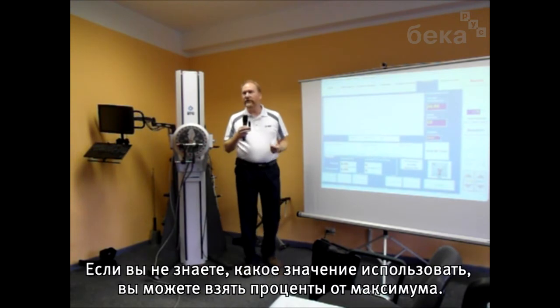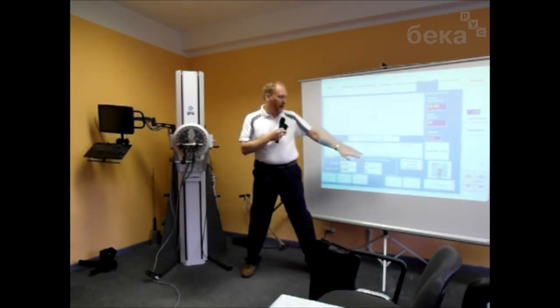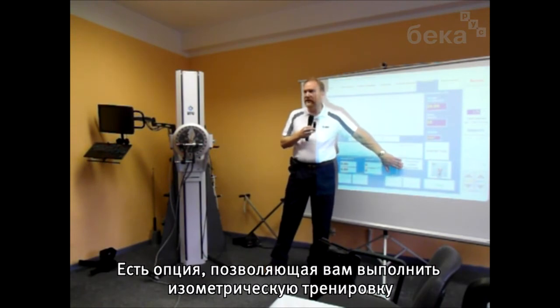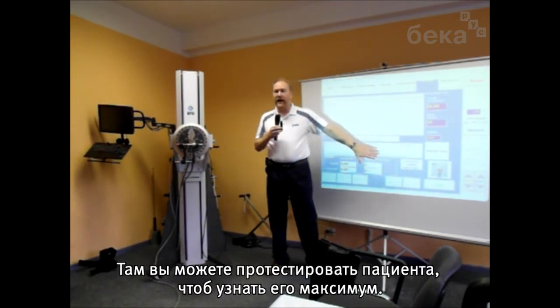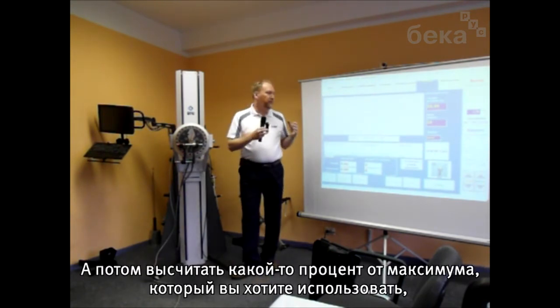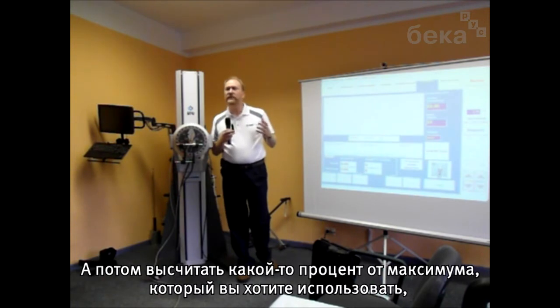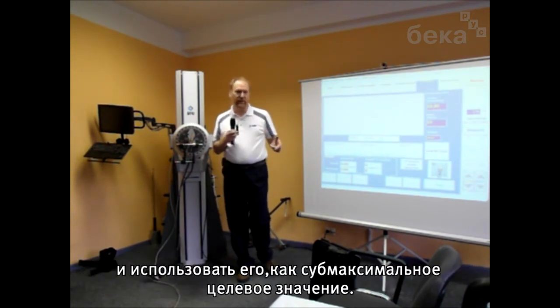So if you know the value you want to use, you can just simply type in that number, and that becomes your target for the exercise. If you don't know the value you want to use, you can take a percentage of their maximum. There is an option to do an isometric trial on the screen where you can actually test the person to their maximum, and then it'll give you a calculator to figure out the percentage of maximum that you want to use as the submax target force.